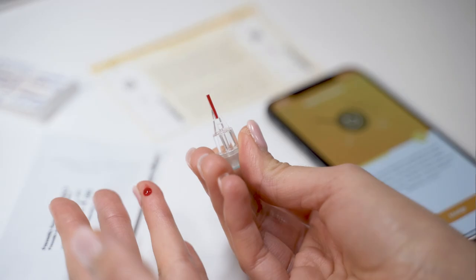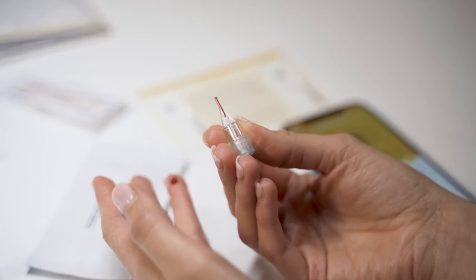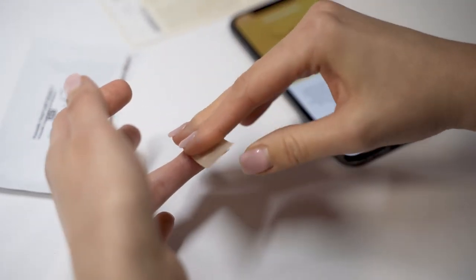If the lancet does not work or accidentally triggers, please do not continue the test. Hold the capillary horizontally against the drop of blood, which will be drawn in by itself. If air bubbles form in the capillary, please do not continue the test — the procedure must be repeated with a new capillary. A correct test evaluation can only be guaranteed with a completely filled capillary. Set the capillary aside as shown and apply a band-aid to the punctured area.